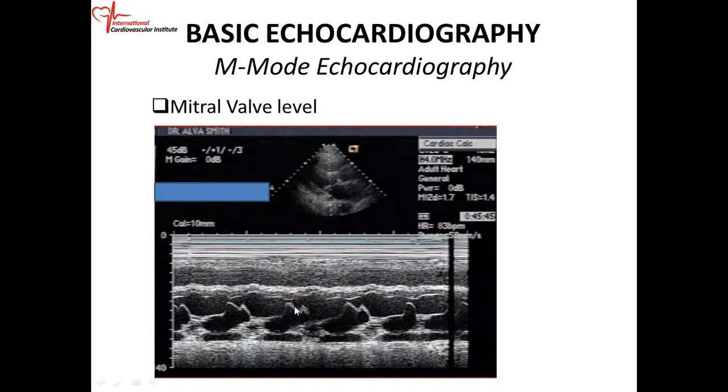You wouldn't know that this is the mitral valve, or that this is a septum. So they had to stick an ice pick, and when they went to pathology, they said, oh, the ice pick is in the septum, so this thing here is a septum. And the same thing for the mitral valve. Oh, this is the mitral valve.